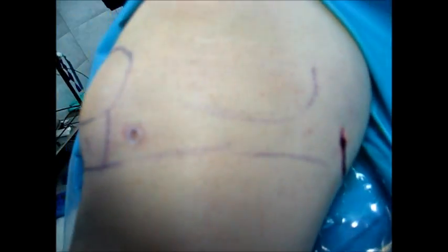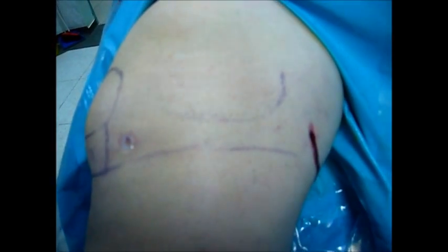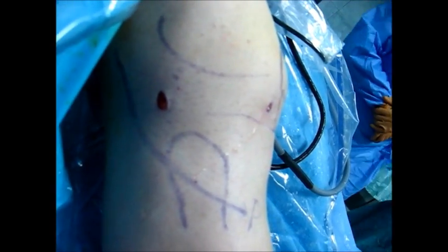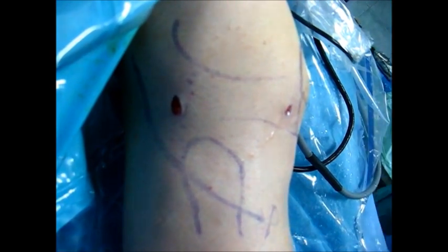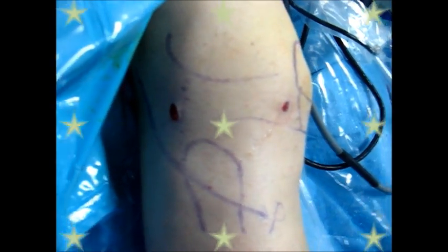This is the posteromedial portal, this is the anteromedial portal, this is the anterolateral portal, and this is the posterolateral portal which we used for the debridement of all the synovium.